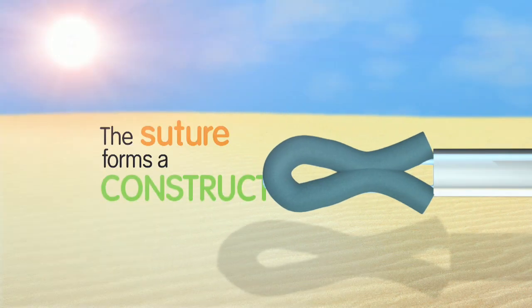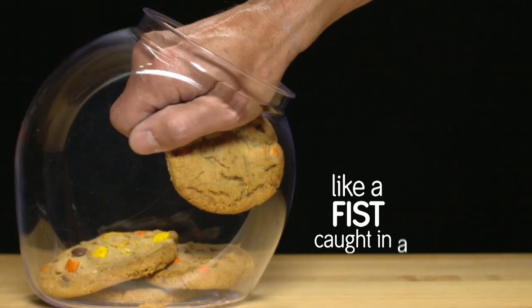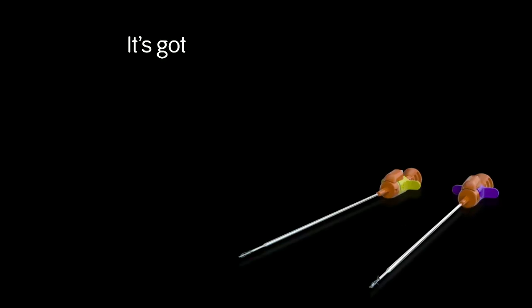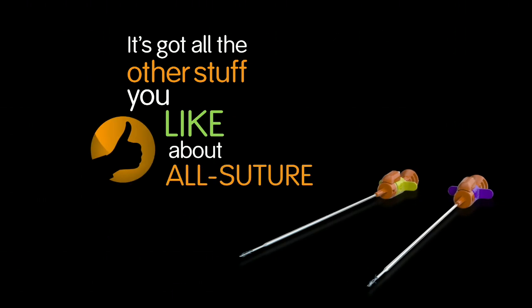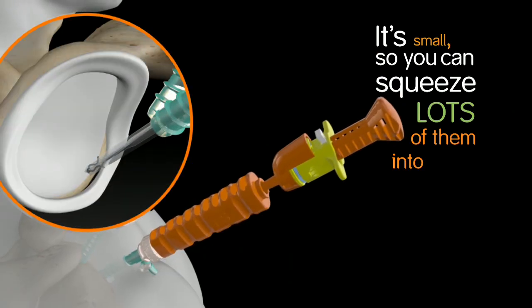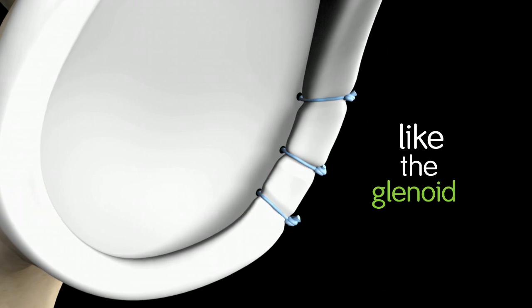The suture forms a construct that's hard to pull out, like a fist caught in a cookie jar. And guess what? It's got all the other stuff you like about all suture anchors. It's small, so you can squeeze lots of them into a tiny space, like the glenoid rim.